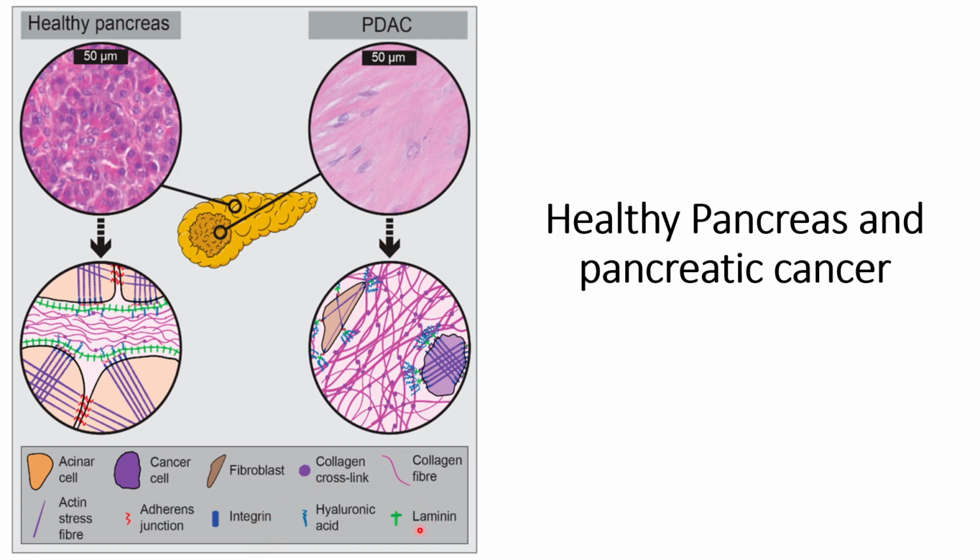And the collagen formations. Because of the tumor microenvironment, the collagen acts as a pro-tumorigenic factor, and one of the things that promote these pro-tumorigenic factors is the high collagen fiber formation. So in the case of pancreatic cancer cells, we can see the high collagen fiber formations, and the crosslinks are also increased.